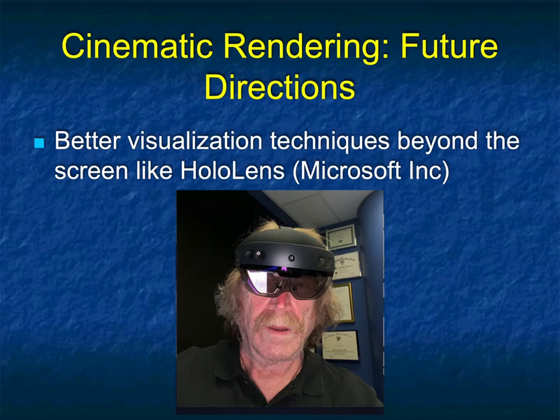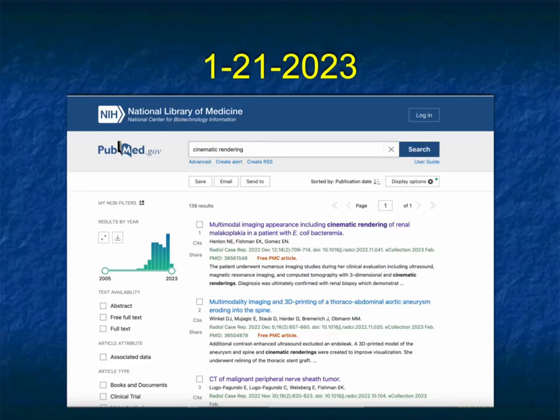And yes, what's nice about these HoloLens 2 is I can still wear my glasses. HoloLens 1, I had to take my glasses off because it would squish your glasses otherwise. So we are making things a bit easier for people like me.